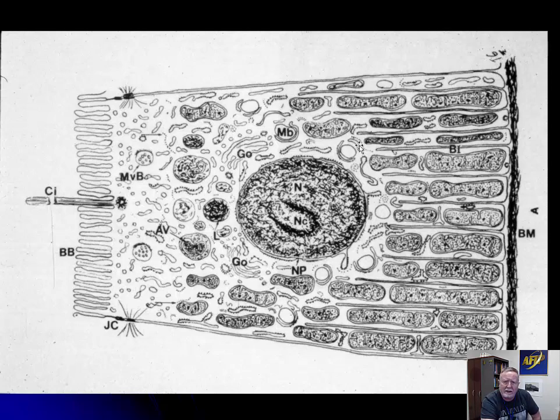We have a nucleus with a nucleolus with some heterochromatin, with some euchromatin, and then we have smooth endoplasmic reticulum here and in here. We have a Golgi apparatus. We have what looks to be maybe a multivesicular body, okay, which are essentially phagosomes with effete bits of nucleus. They'll float around. Here's the rough endoplasmic reticulum with those ribosomes that stud it.